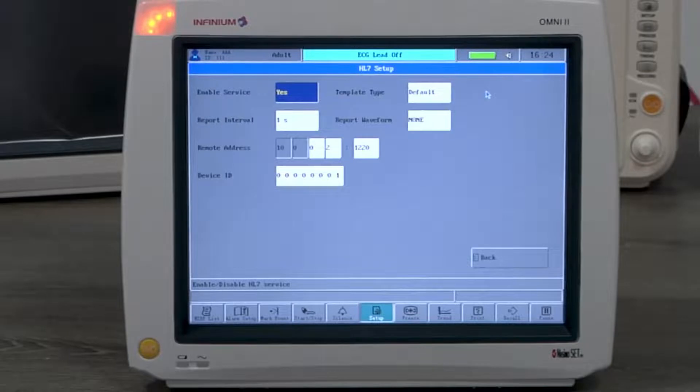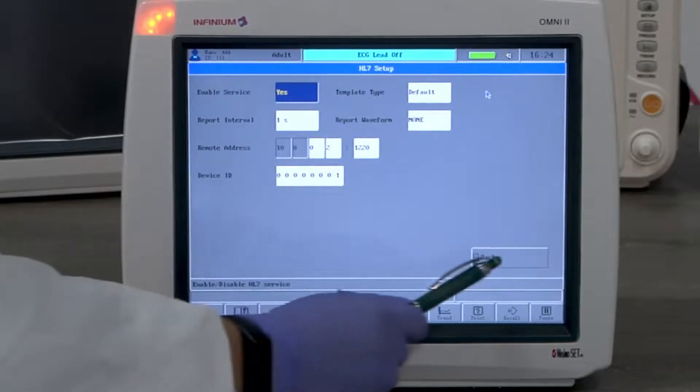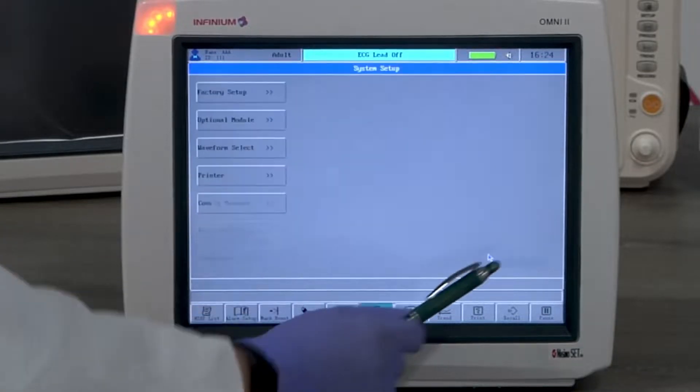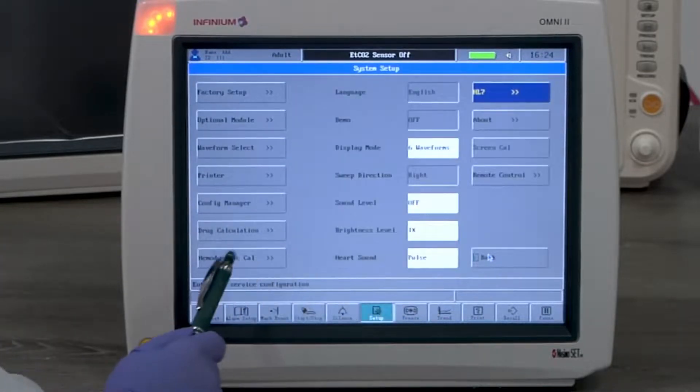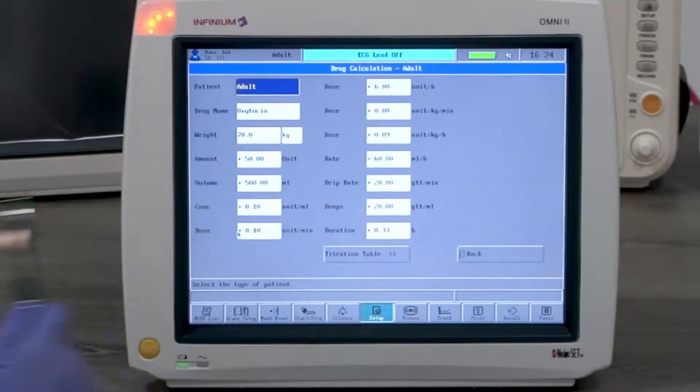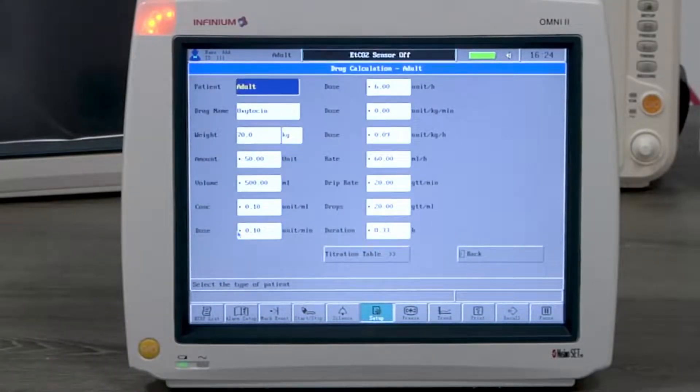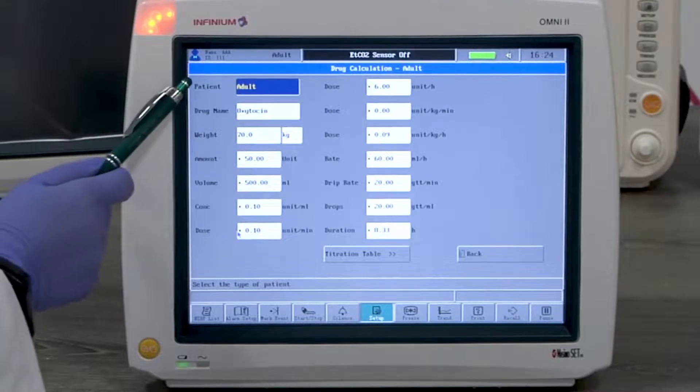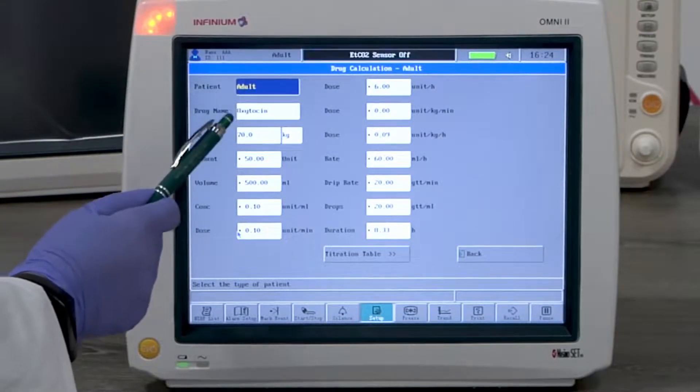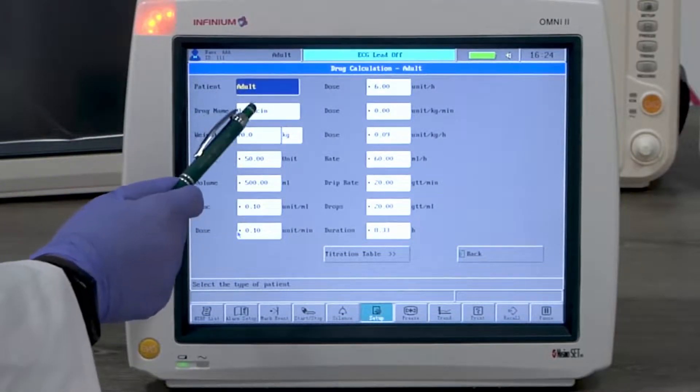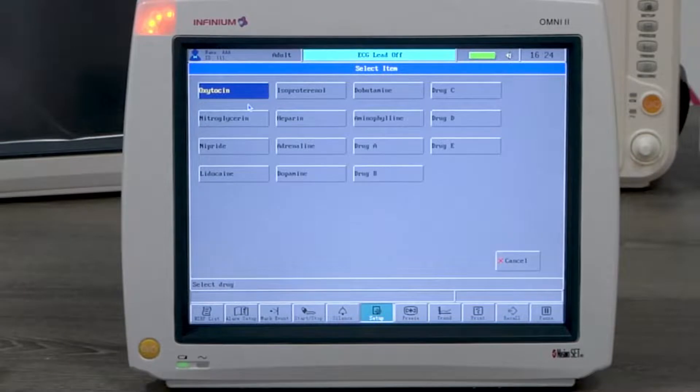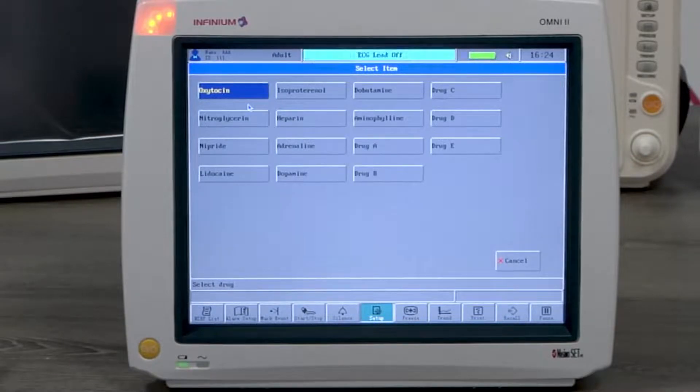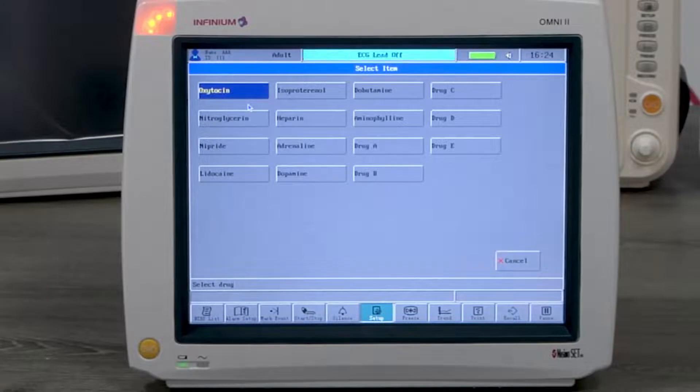Drug calculation is a calculation feature. It'll calculate the dosage based on the information you put in. You'll start with selecting the patient type and the drug name. If the drug needed is not listed, you can select drug A, drug B, drug C, drug D, or drug E.